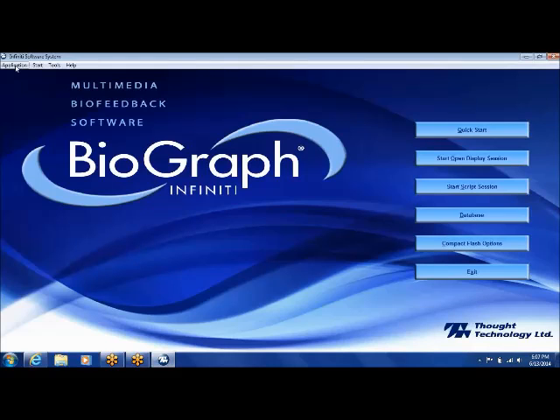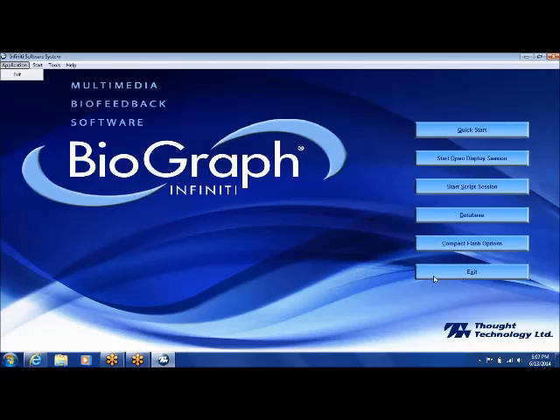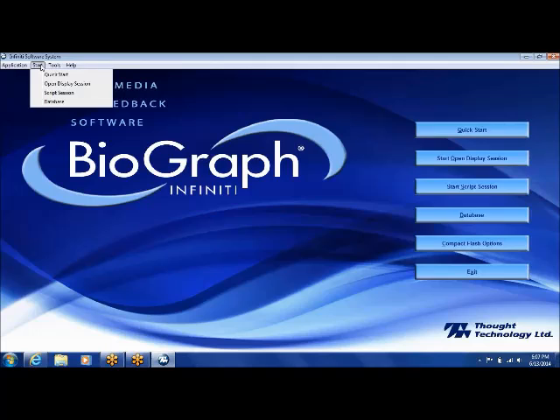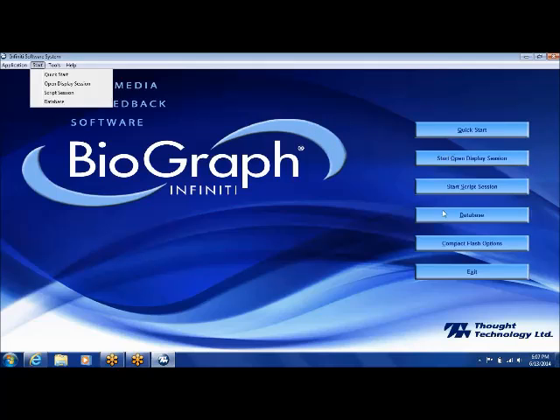Going quickly over these buttons: the application button doesn't really do anything except give you the option to exit, which usually we wouldn't use for that anyway — we would use the button over on the right to exit. The start button allows you to do quick start, open display session, script session, and database. I don't tend to start those functions that way; I use the big buttons on the right side of the screen. They're much easier to get to.